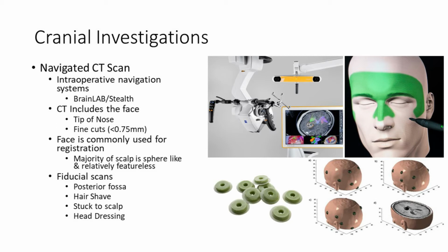On craniometric points, on pure measurements, you can be slightly off, and for some operations it's quite critical that you're spot on.